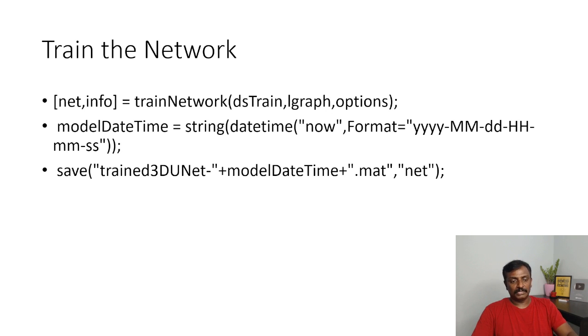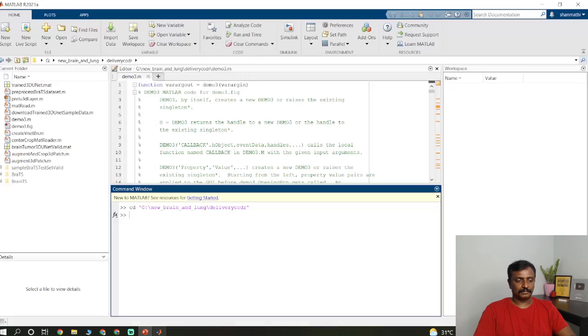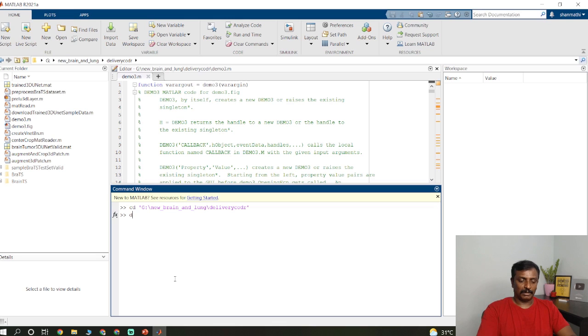So I will show you the demo. I am not going to run the training process, as it is going to take more time. Just go to MATLAB. So the first thing is to change the path. Once you change the path, you run the main program.